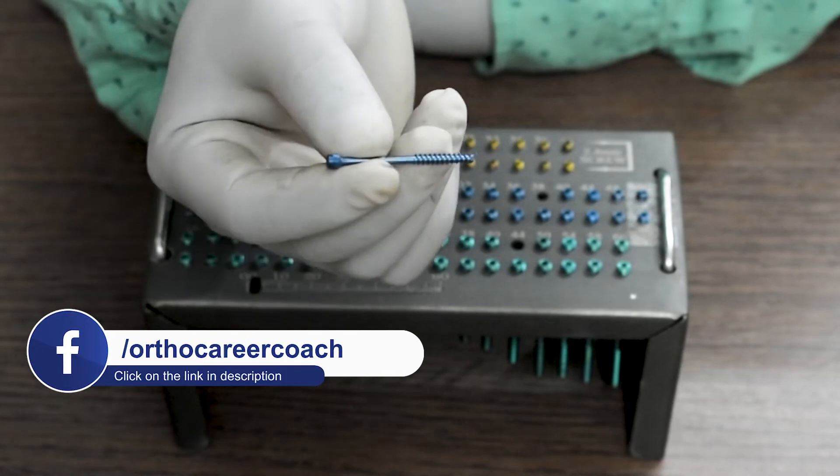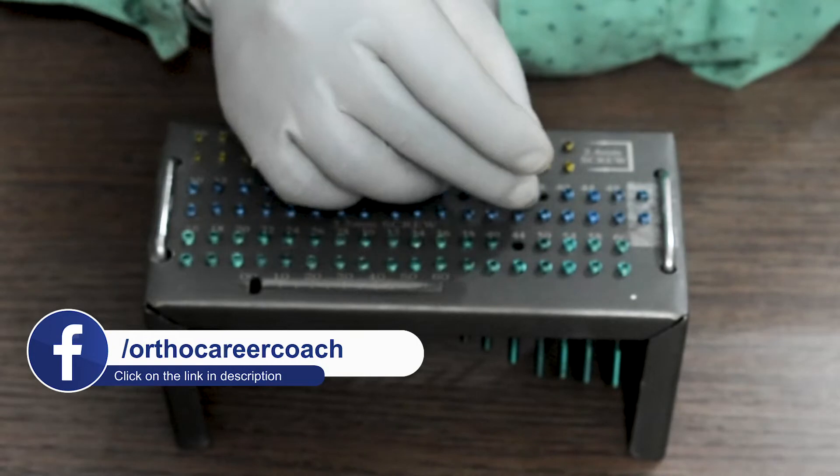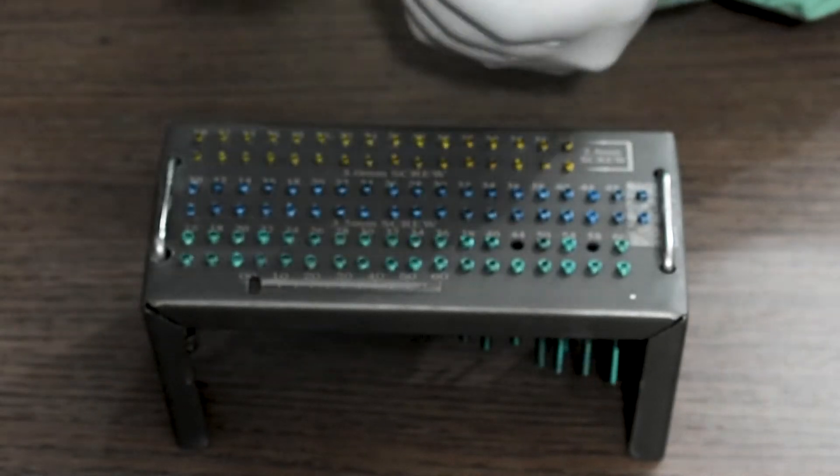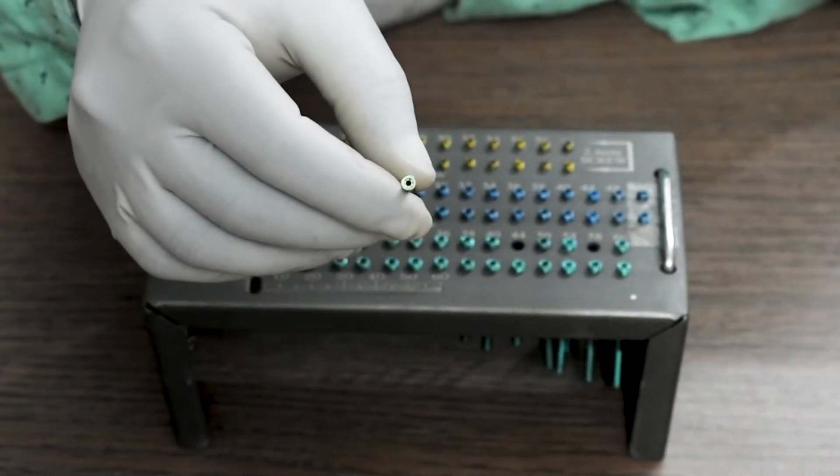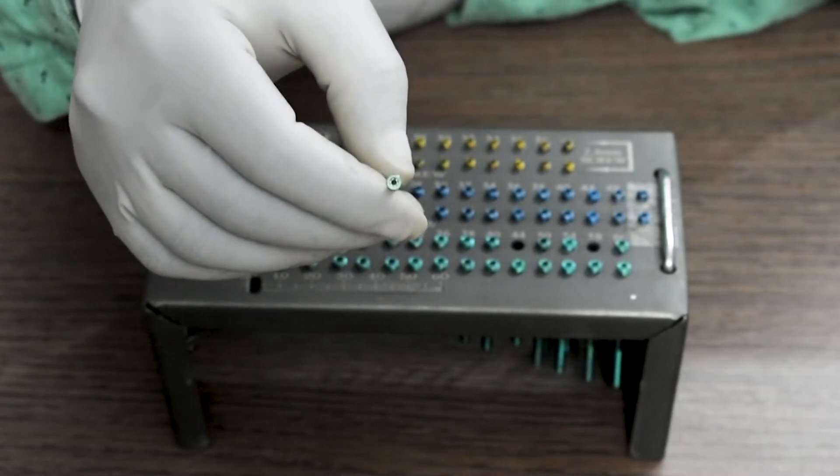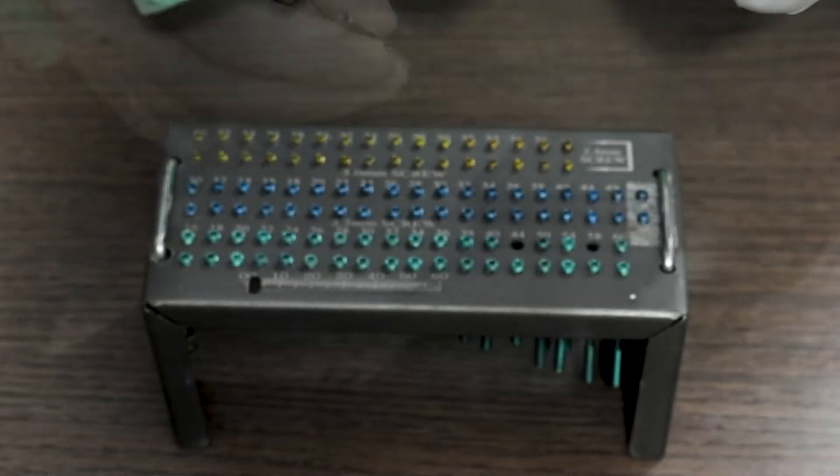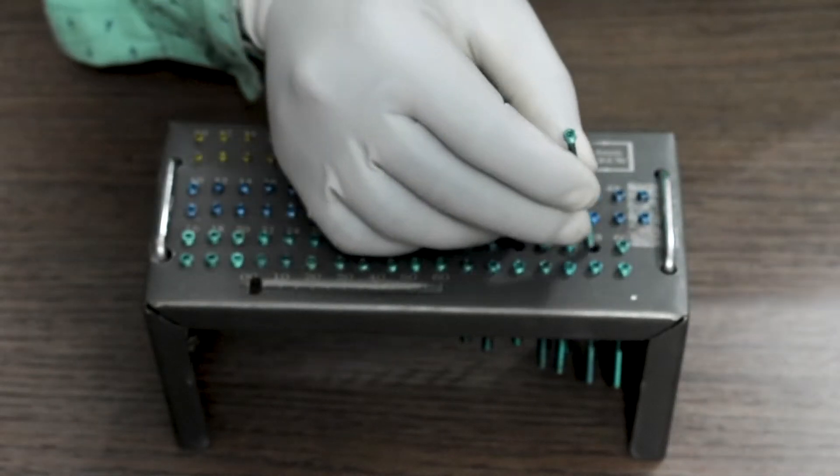This one is a 3mm Special Herbert Screw, it is also cannulated. And this one is 3.5mm Special Herbert Screw, again cannulated. It is called a headless screw because it completely goes in the bone along with the head.